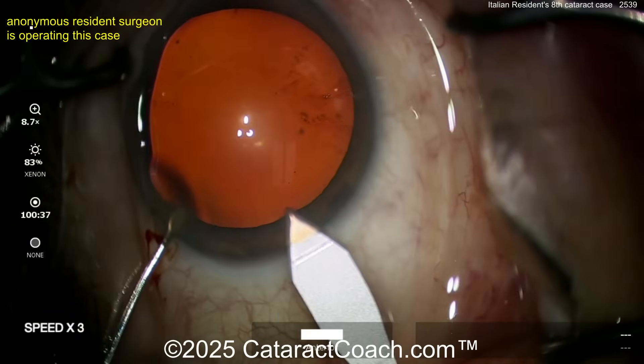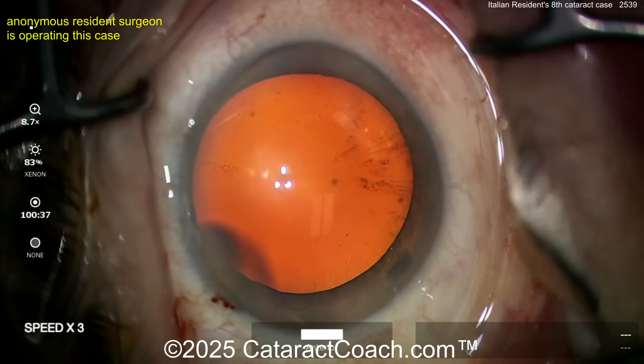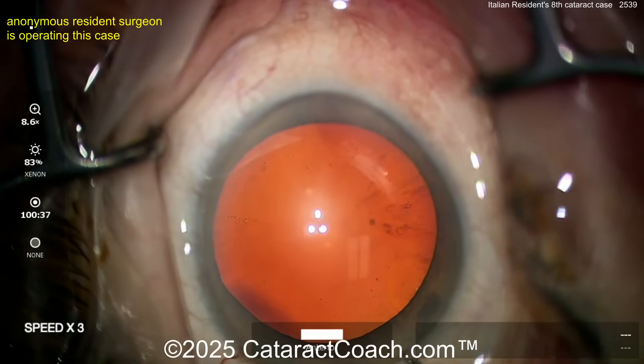I was recently at the Italian Cataract Factor meeting, and I learned a lot. Let's see the incision here — it's pretty darn good for case eight.